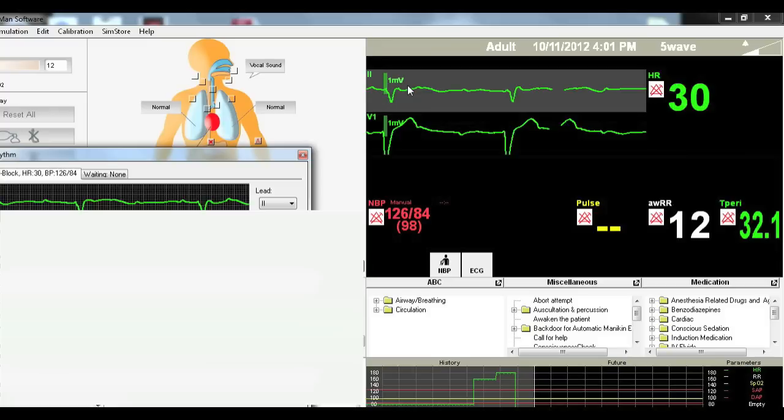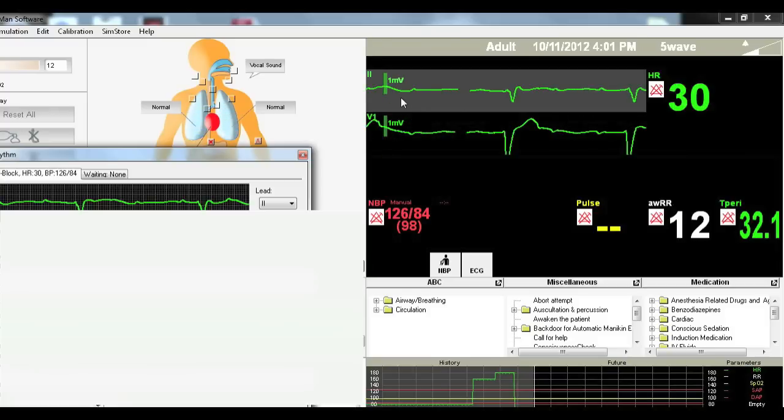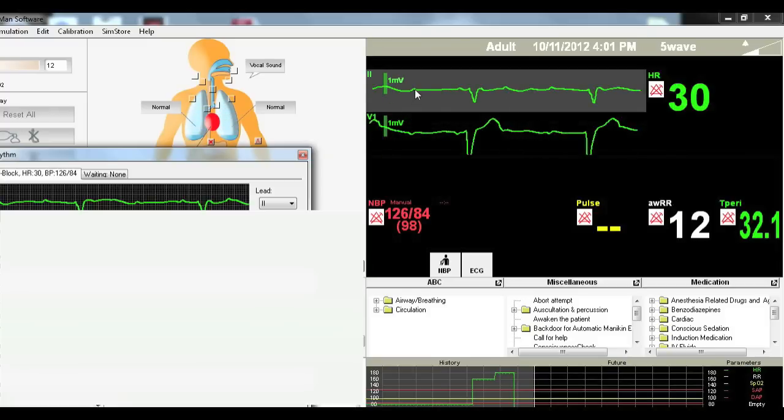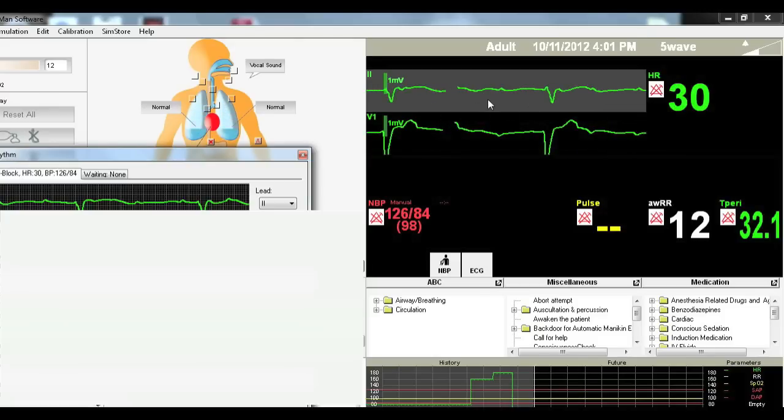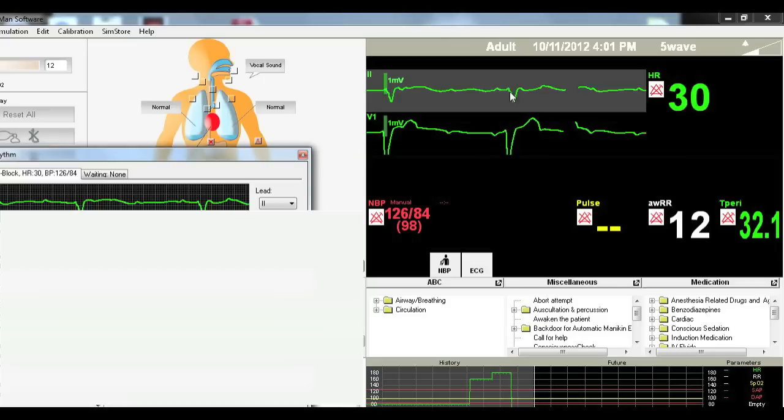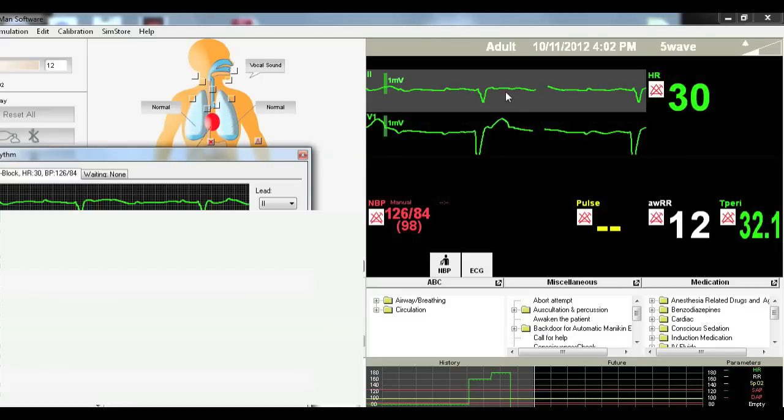But just know that they can be different presentations. The main thing to look at here is that you have random P waves. They're not followed by QRS waves. So your P waves are just going random. They're crazy. They're not doing anything. And your QRS complex is occurring all by itself randomly.